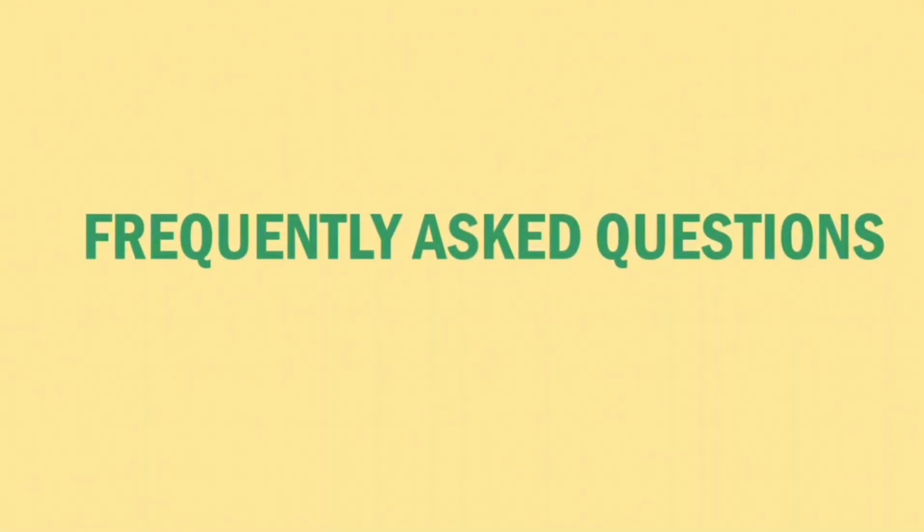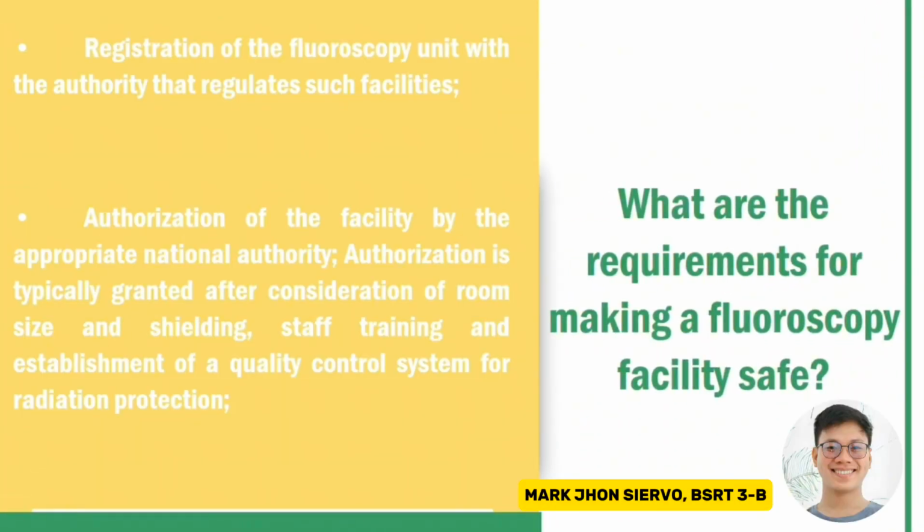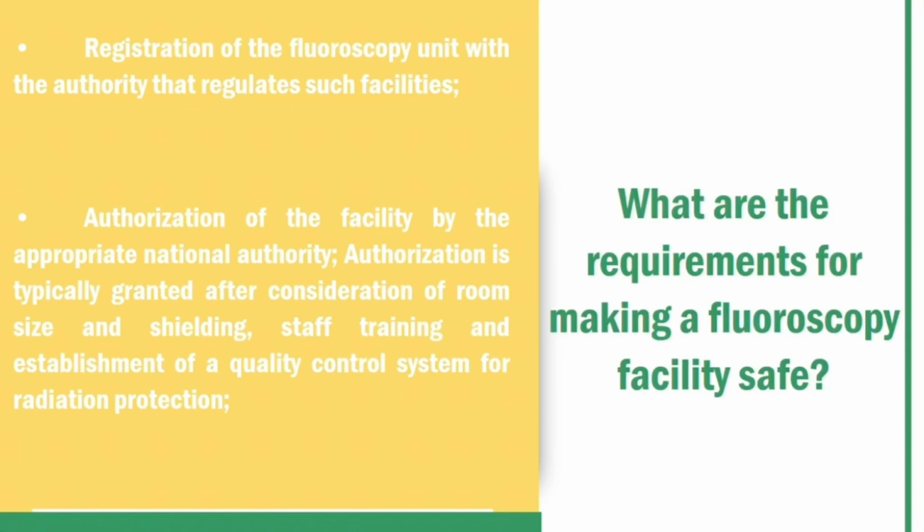Frequently asked question. What are the requirements for making a fluoroscopy facility safe? The following requirements need to be met to ensure that a fluoroscopy facility is safe: registration of the fluoroscopy unit with the authority that regulates such facilities, and authorization of the facility by the appropriate national authority.